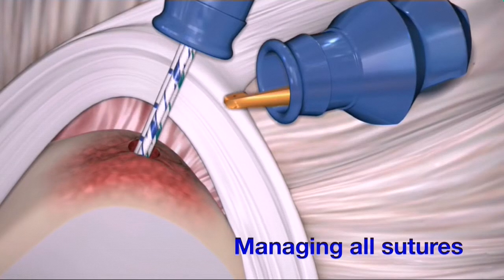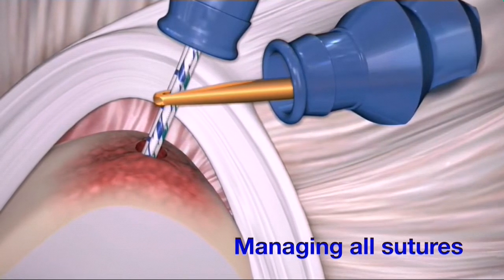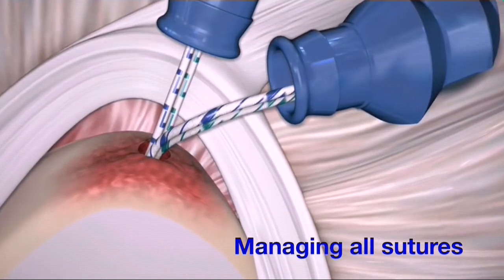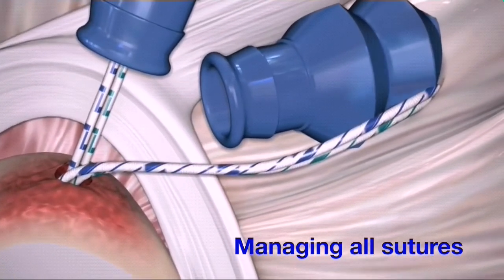With a crochet hook, retrieve the two sutures nearest the glenoid side of the implant eyelet, one of each suture color, and pull them back into the anterior mid-glenoid cannula. Utilizing a switching stick, the sutures are then stored outside the cannula.